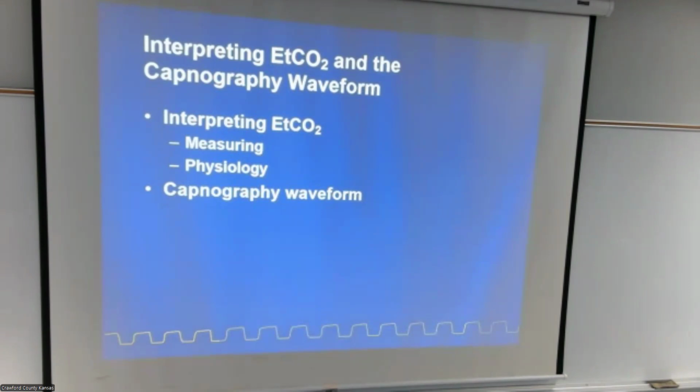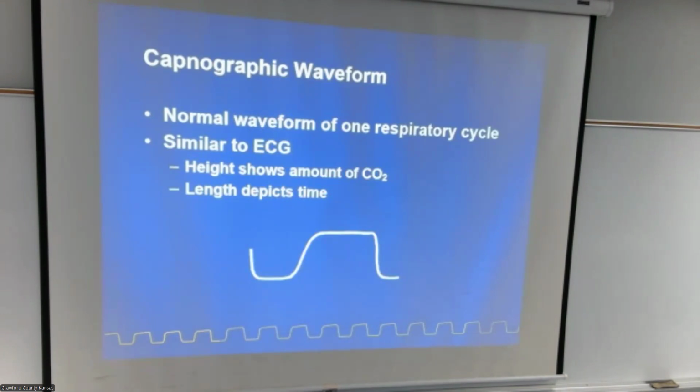So we're going to interpret the end-tidal CO2 by measuring the physiology of the capnography waveform. That's all what we're looking at. I mean, the numbers are great, but we actually want to see the waveform and what they represent, and the phases of the waveform and what those phases tell us. Like a normal waveform in one respiratory cycle, and this is exactly what it looks like.